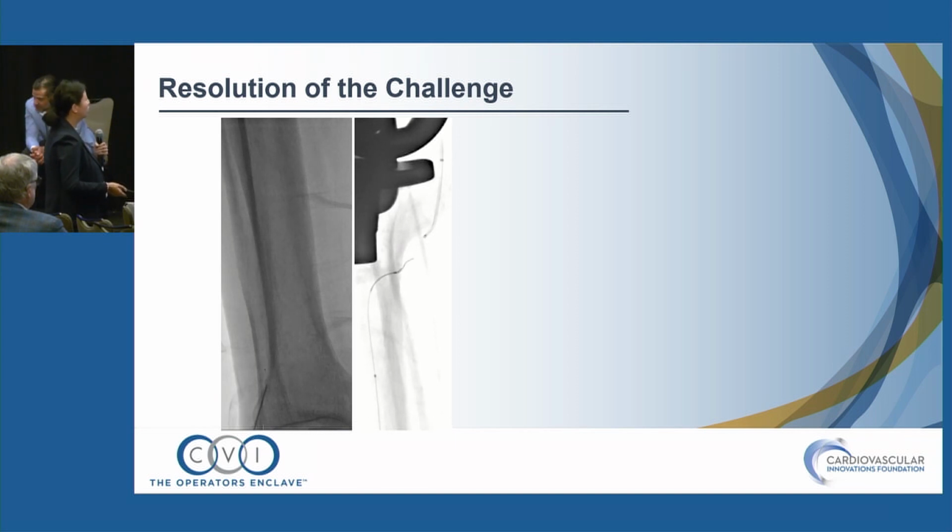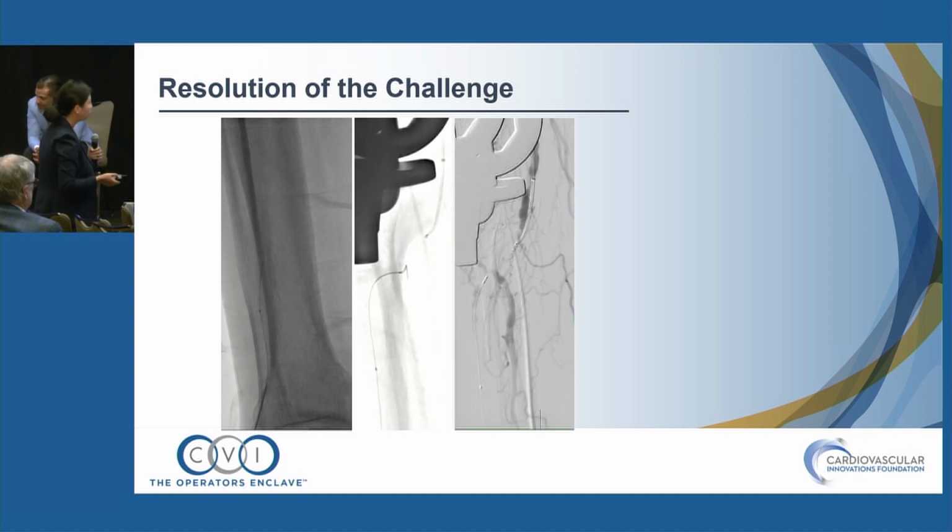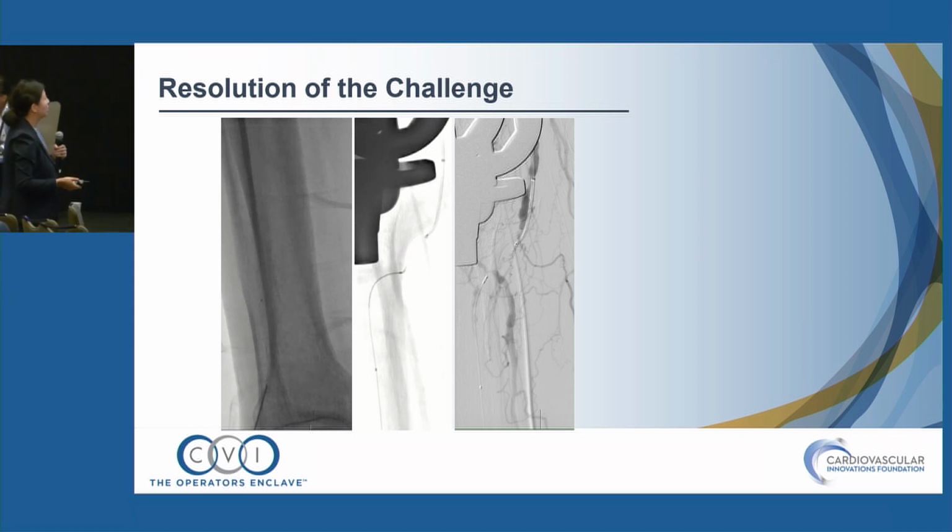From a retrograde standpoint, I obtained ultrasound-guided access into the anterior tibial artery. You can see this, and I'm sorry for the knee prosthetic, which made the angiogram very bright, but there's a really steep 90-degree turn from the anterior tibial into the popliteal, making it virtually impossible for me to penetrate the distal cap. At this point, I took an angiogram. From the top, you can see I'm subintimal in the P3 segment.